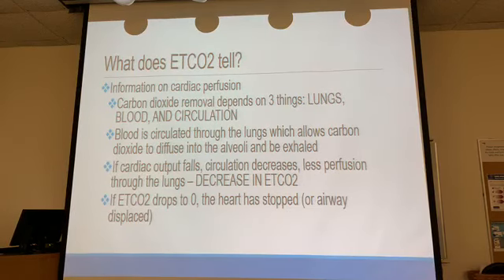So the second thing end-tidal CO2 tells us about is perfusion. We talked about how you can use end-tidal CO2 with monitoring respiratory status, knowing how you intubate, figuring out is this a CHF wheeze or an asthma wheeze. The other thing that it tells you is perfusion. Nothing about pH. Remember, we don't try to figure out what's going on with the pH and whether we need to give bicarb or whatever with end-tidal CO2. We use it to figure out what's going on with their breathing and what's going on with their circulation.